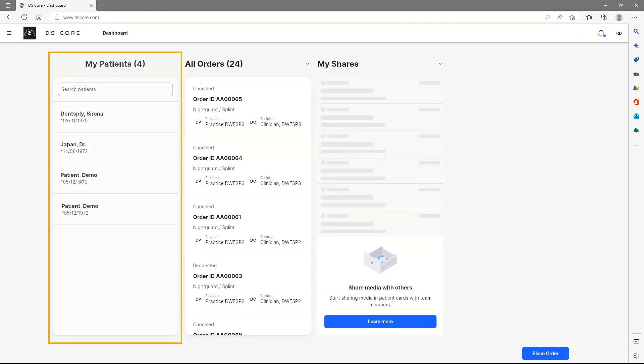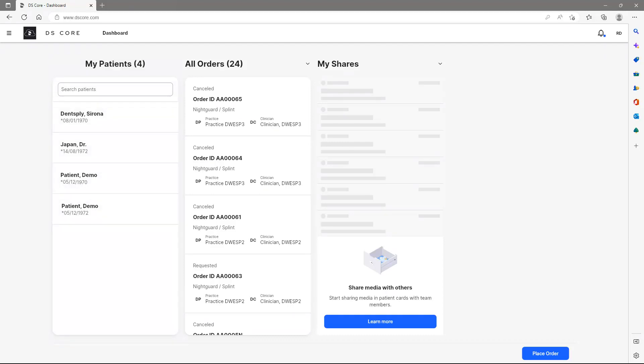The uploaded media will be organized by patients and together with case files from other Dentsply Sirona Solutions, a comprehensive media library that supports your workflows, patient communication, and collaboration with other dentists and labs will be created.